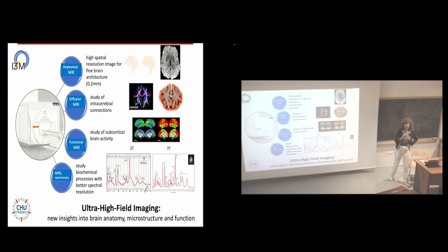For the moment, we have only antennas in 7 Tesla MRI for brain and for articular problems, that is to say for ankle, for knees. And very quickly, we will have antennas for kidney, for heart. But for the moment, 7 Tesla is dedicated essentially to brain.